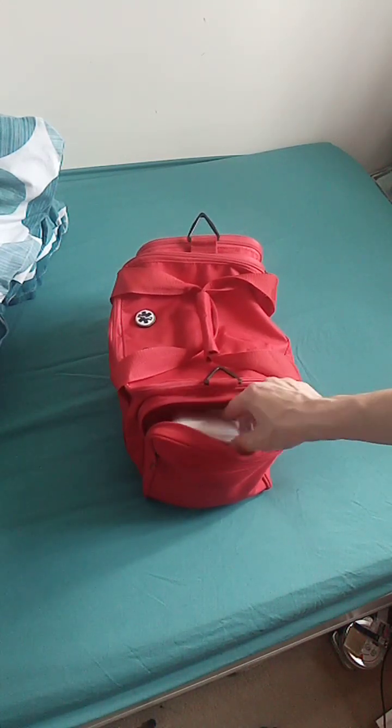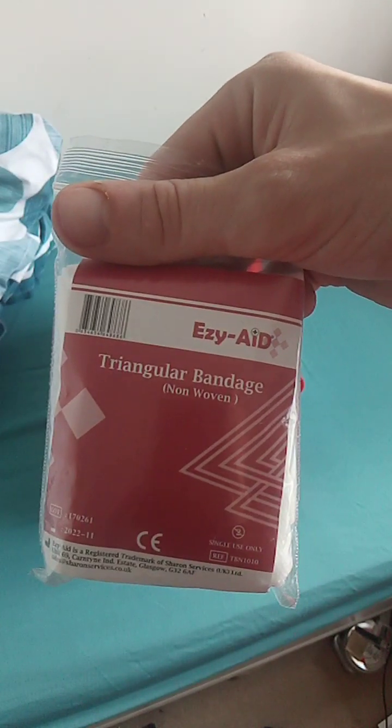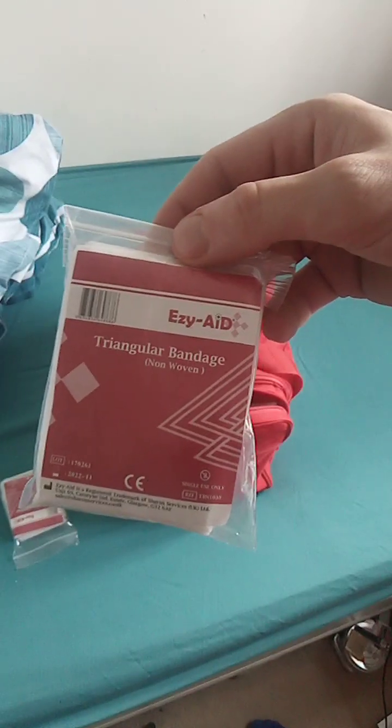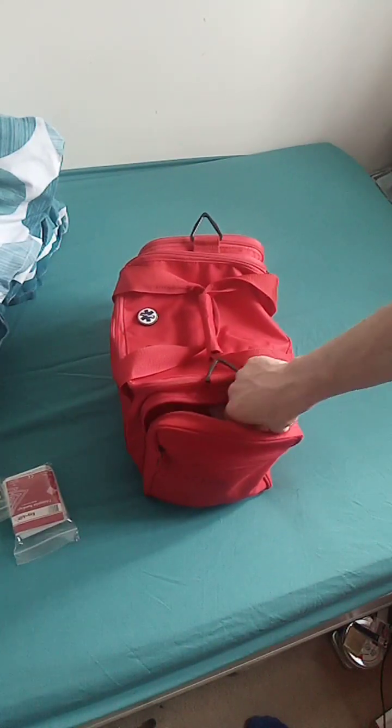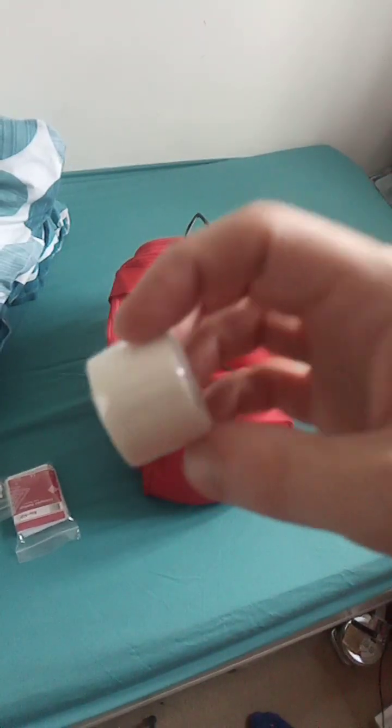In this outside pocket: triangle bandages - two, I know I had two. Some tape for keeping stuff in place.